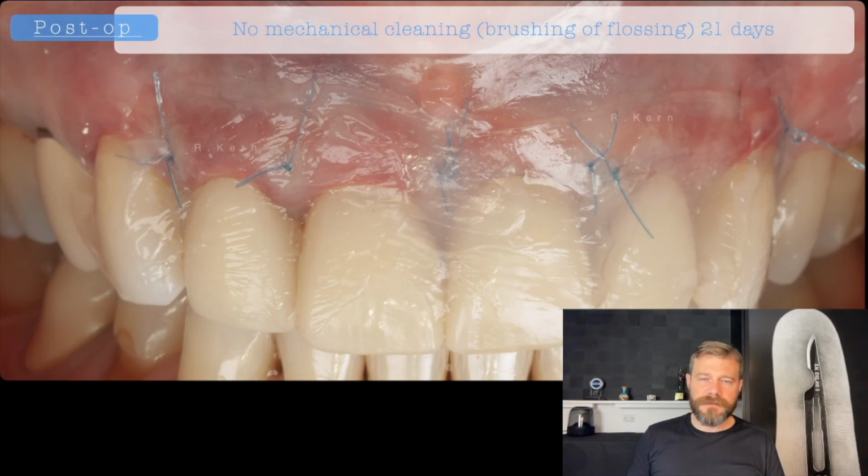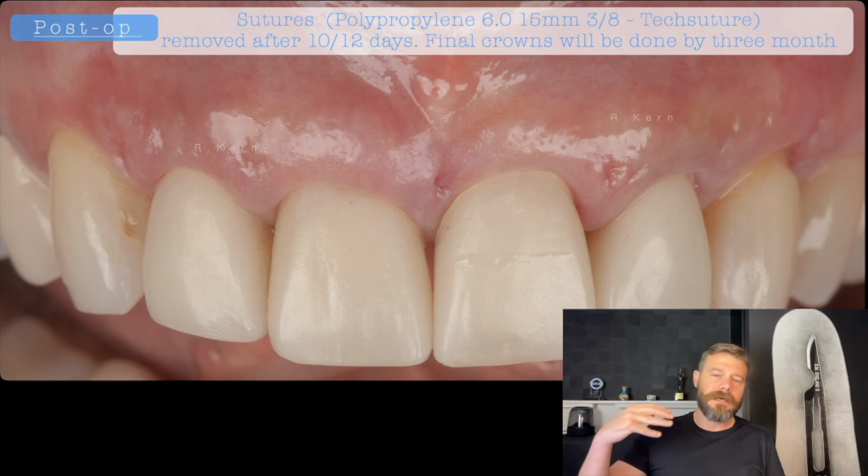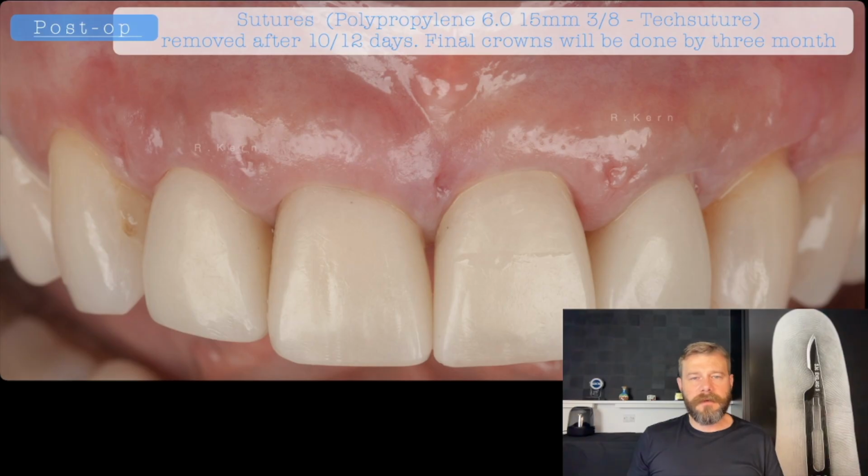In some cases we still use chlorhexidine, but most of the time now you are using Blue M gel, an oxygen-based gel, for the patient to take care and keep the area clean. Okay, this is the post-op for our patients. Between 10 to 12 days, when you remove the sutures, you see a different position of the soft tissue margin, a different color of this area here. So really all that was needed, the point that we wanted to achieve for this case, was already delivered.